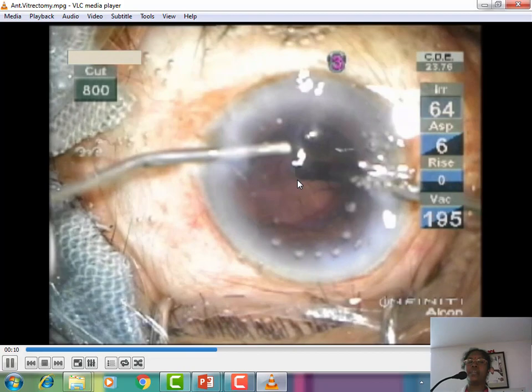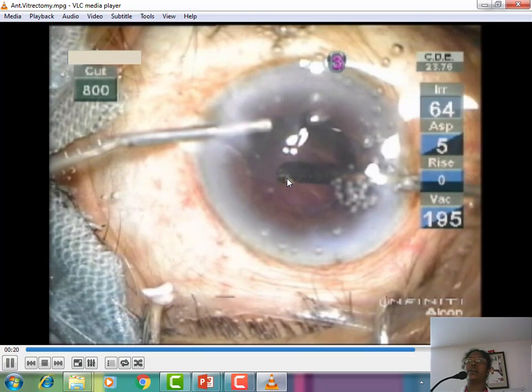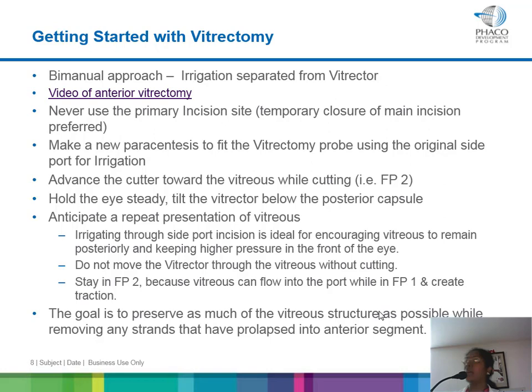The cutter goes just below the posterior capsule to start cutting the vitreous. Always make sure the aspiration port is facing upwards — when it faces down, you tend to go deeper and may not know what you are cutting, risking traction. Do not move the vitrectomy cutter when in foot pedal 1 or 3 — only move when in foot pedal 2, when you are cutting. Do not try to go to the peripheries; stay centrally and not too deep to avoid major complications.